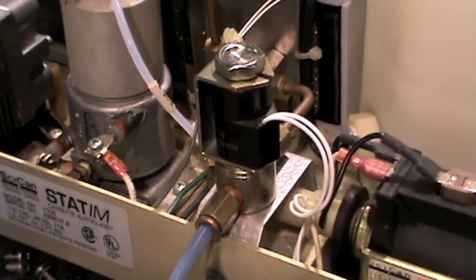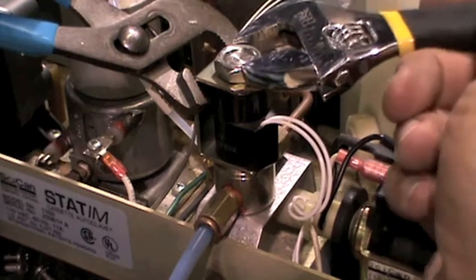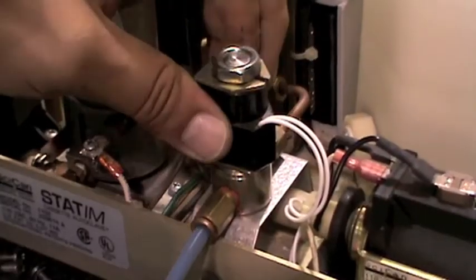Once the valve is reassembled, plug the sterilizer in and check for proper function. As you can see here, even something as intimidating as rebuilding the solenoid in the Statim can be quickly and easily accomplished with a few simple tools.